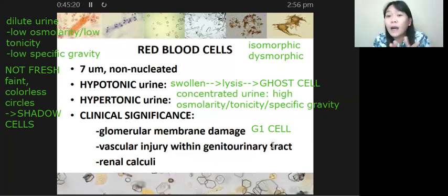Diba? O yan, pag kunwaring sisiksik yung RBC. Diba? Syempre, pag sisiksik yan, magkakaroon ng parang buntot yan. And that is the protrusion or the blebs, yung pagsisiksik. Kaya wag kayong siksik ng siksik dyan, okay? Yung pagsisiksik ng RBCs through the endothelium, doon nagkakaroon ng protrusions or ng blebs. Thus, nagkakaroon tayo ng dysmorphic RBC. Okay, ayan. So clear yan na. Dapat naintindihan nyo yan.